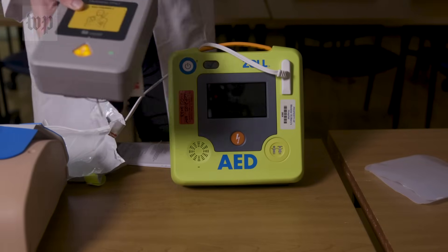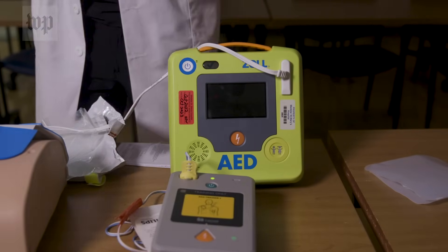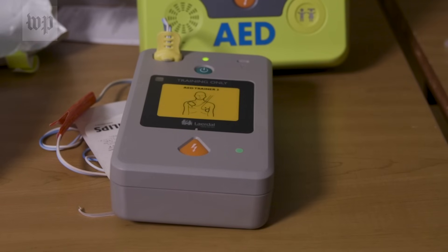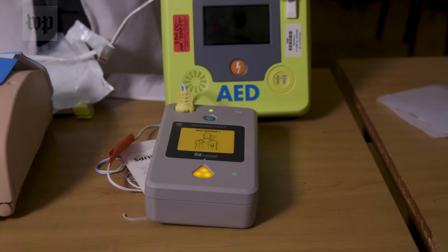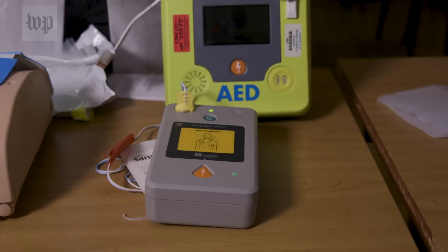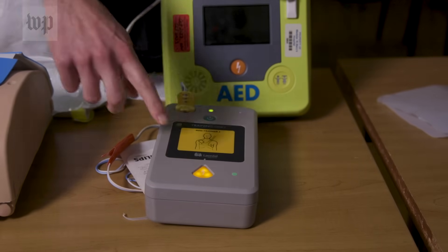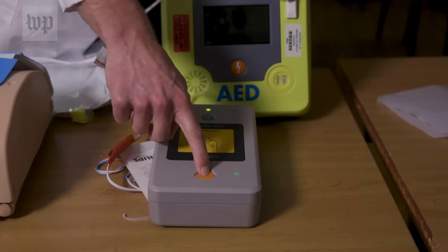When it is analyzing the rhythm, you would hear something like this: 'Stay clear of patient. Analyzing. Shock advised. Stay clear of patient. Deliver shock now.' So in this case, you would press the button to deliver the shock, making sure that no one is touching the patient, so that you stay clear of getting shocked yourself.